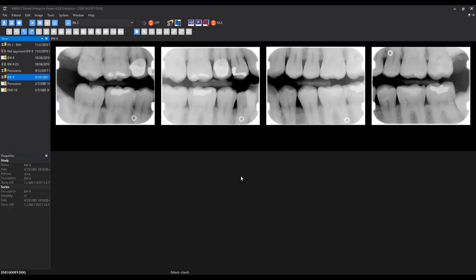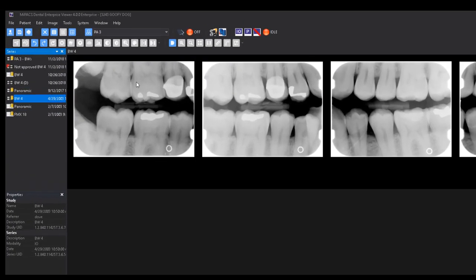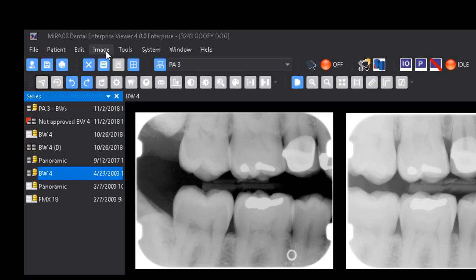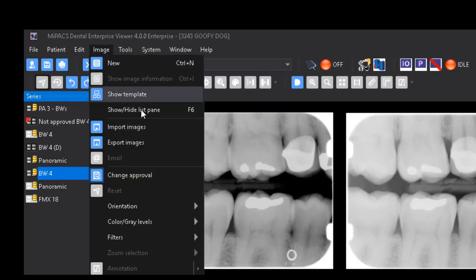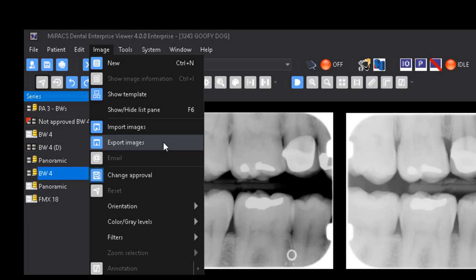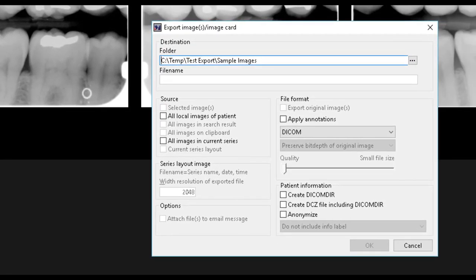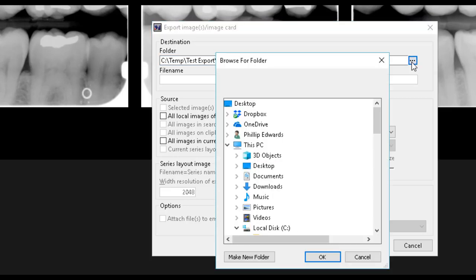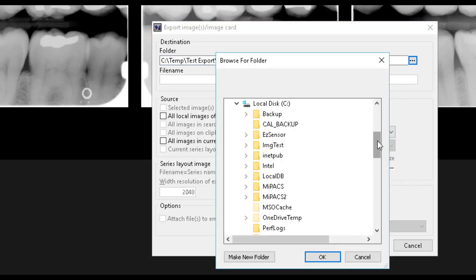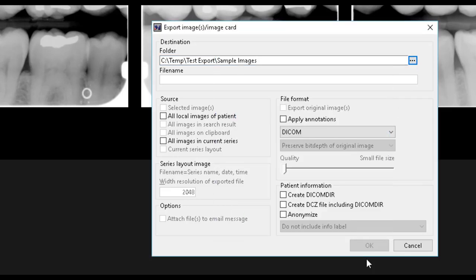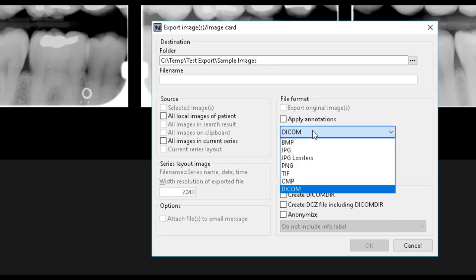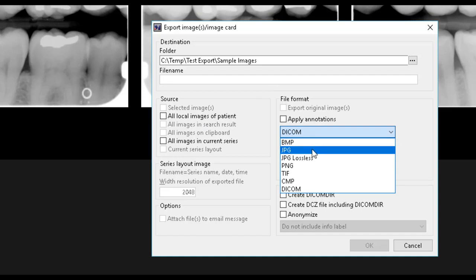The MyPax viewer also allows the exporting of images. To export images, select Image, Export Images. The Export Images dialog is very similar to the Print dialog. First, you will want to select a destination folder. You can use the Browse button to help navigate to the appropriate folder. Next, select the file format for the exported images to be saved as. After you have selected the file format, it is time to decide what images you would like to export under the Source option.